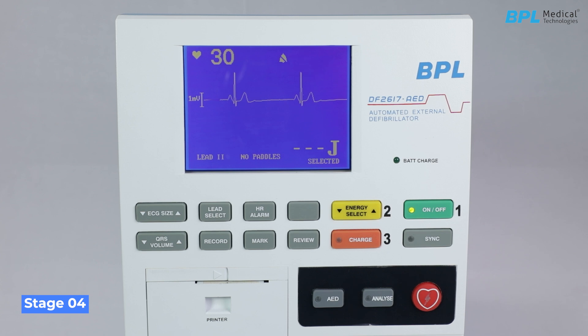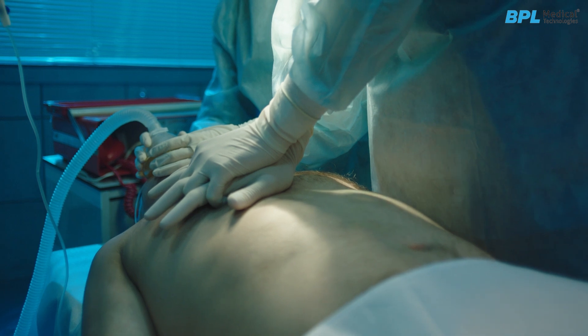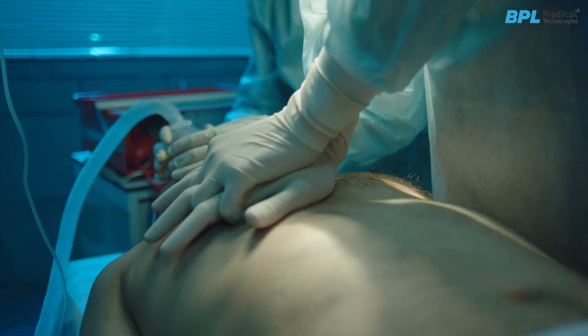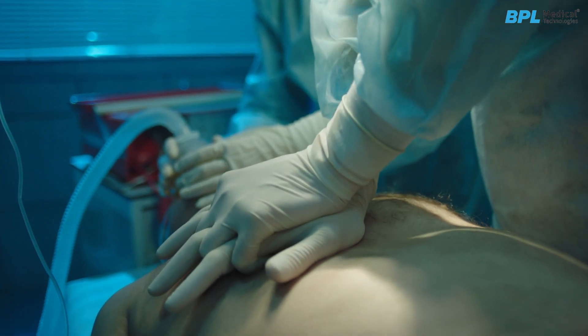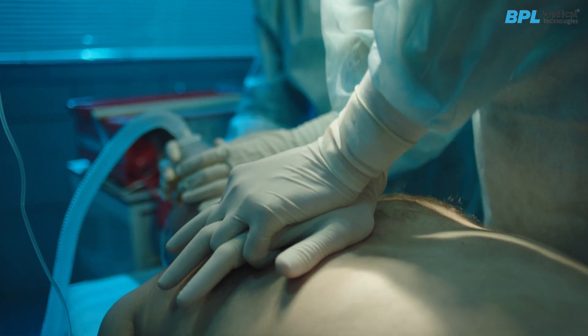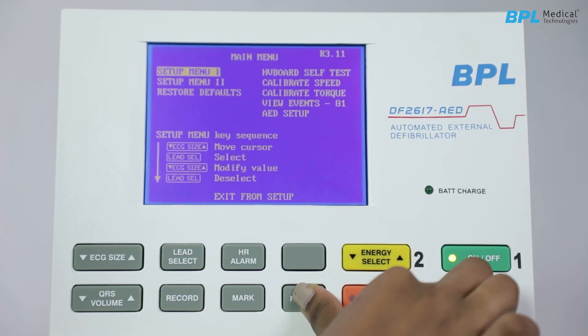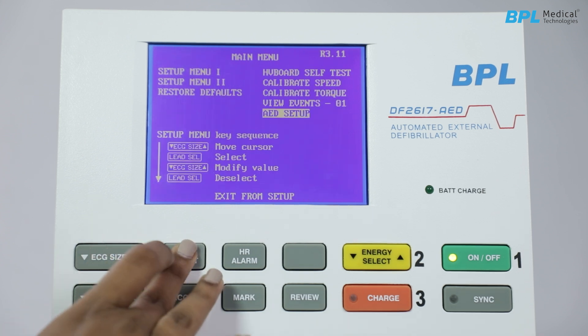Stage 4 — CPR stage: The DF-2617 AED moves to the CPR stage. During this stage, the CPR cycle will start. The default setting is for 5 cycles. The user is prompted to administer 30 chest compressions followed by 2 ventilations. To display the main menu, press the review and sync keys while switching on the defibrillator. A main menu with various options will appear, including Setup menu and AED setup.